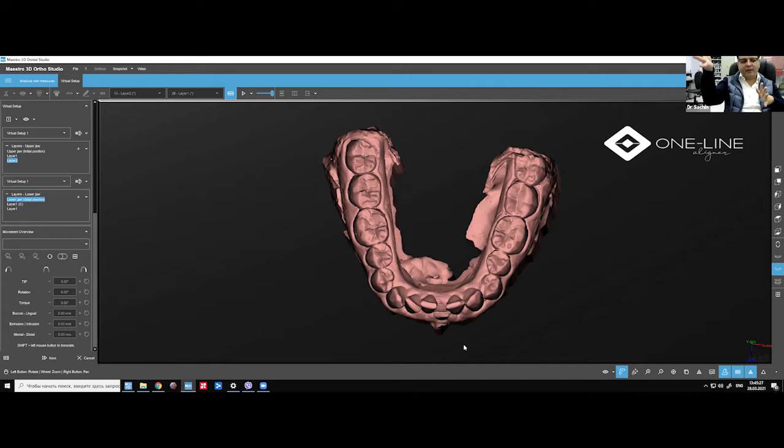Or 0.5, as our friend Nicholas uses, which I do agree with maybe in the beginning. So if somebody wants to use in the beginning 0.5 or 0.65, we also have CA 0.65. It's the medium one from the clear aligner. Yes. We do start sometimes with CA and then go on to Pro Plus, or we start with Pro Plus and then we go on to CA, depending on the case.